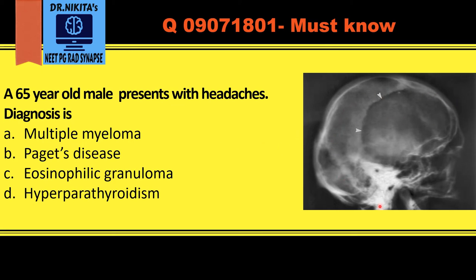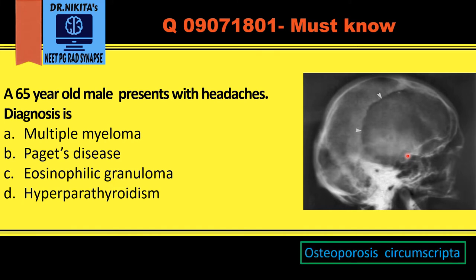In this radiograph of the skull, we see a well-defined lytic lesion in the frontal bone. It is very well differentiated from the adjacent normal bone. This looks like osteoporotic bone — a lytic lesion that is very well defined and circumscribed. So this is osteoporosis circumscripta, which is seen in Paget's disease.